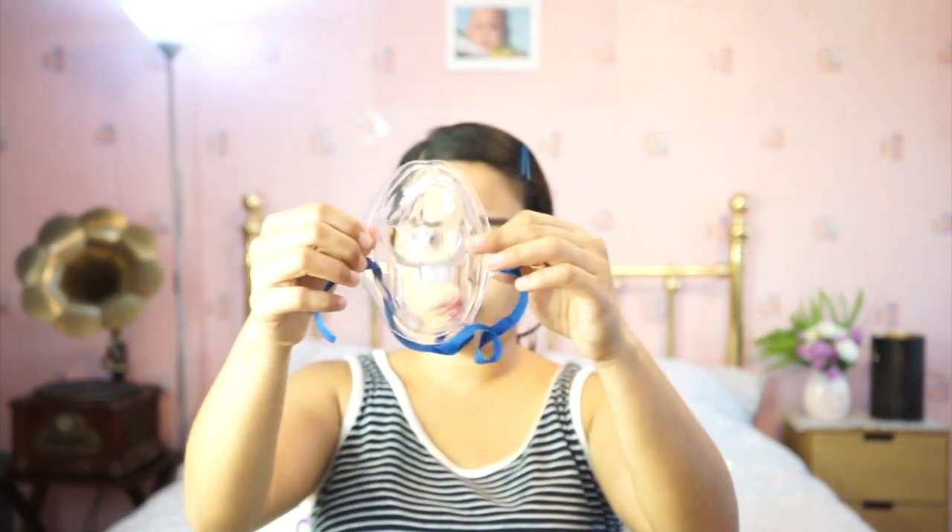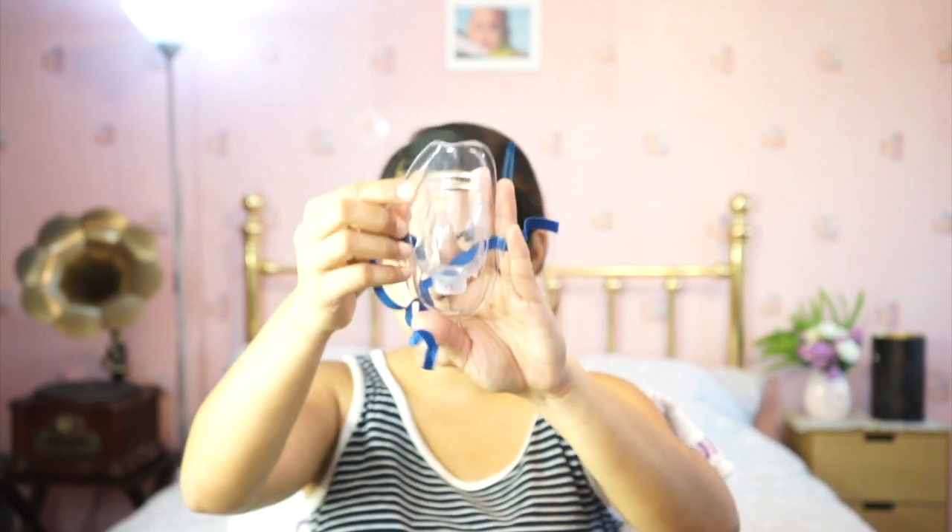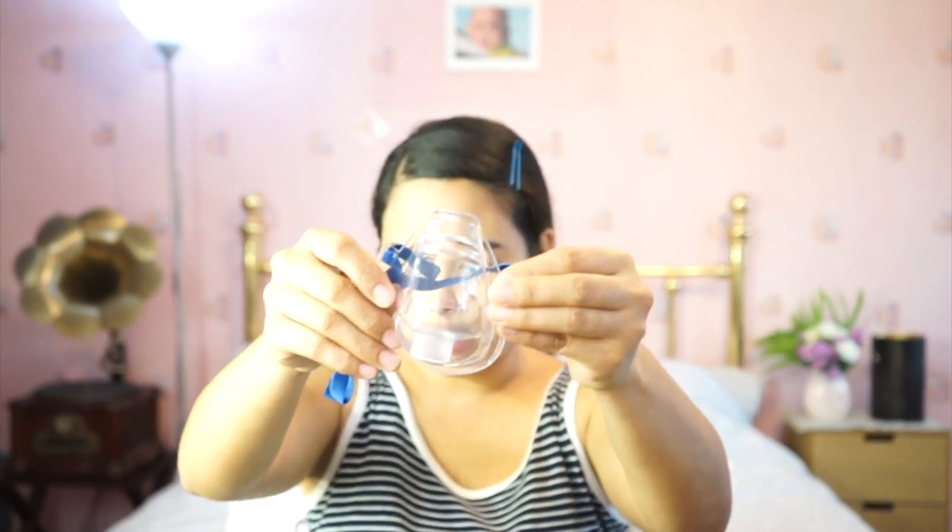It has two masks: one for adults. The old one has metal plates but I think there's one here too. You'll also see a pediatric mask for babies, though it's not for infants.